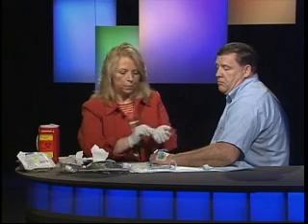Your patients need to know if something feels wrong in their hand, other than the awareness that there's an IV in the hand. They need to know that there is a feeling of redness or heat or anything that's untoward or uncomfortable that they should tell you at the first possible second. When I have finished with this, I will secure this to the extremity by using these securement tapes that were supplied in my tray.